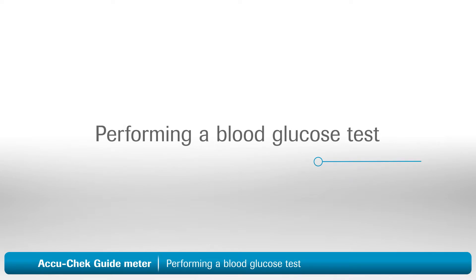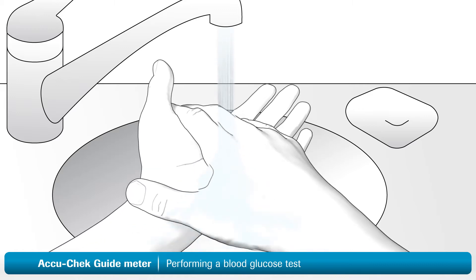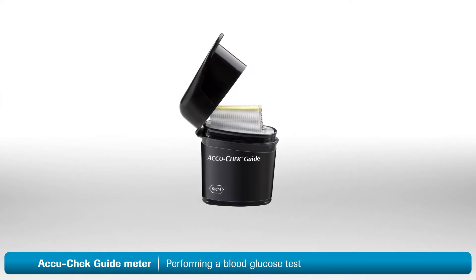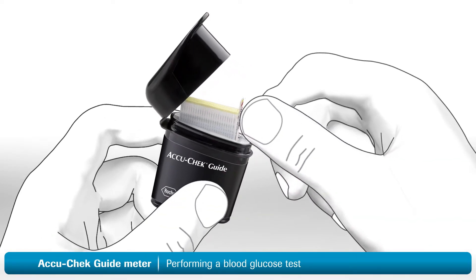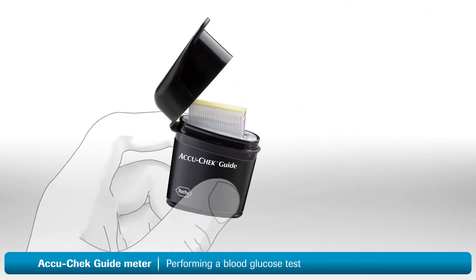Now you're ready to do a test. First, you'll need to choose a finger to take a sample from. It's best to alternate between fingers as they can become sensitive over time. Remember to always wash your hands with warm, soapy water and dry them thoroughly. Take a test strip from the spill-resistant test strip vial, and always remember to close the lid tightly — this helps protect the remaining strips.